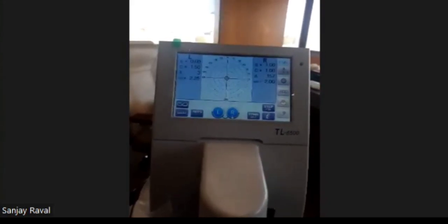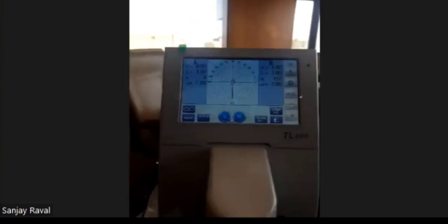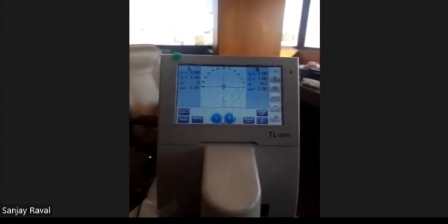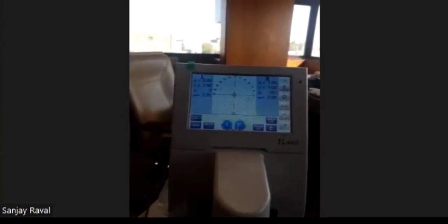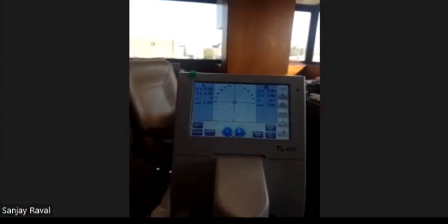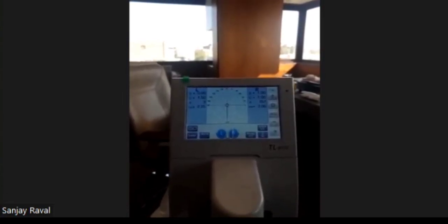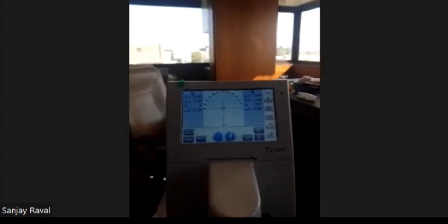Are there any questions from the audience? Yes, sir, I have a question. Please. What's the calibration of this instrument? Doctor, this is basically an auto calibrated machine. The moment you switch on the machine, it gets calibrated automatically. Since it follows wavefront technology, the wavefront system does not require periodic calibration. For testing the calibration, I suggest that you periodically check your trial lens set itself. The trial lens case is already there. You can just keep on checking.